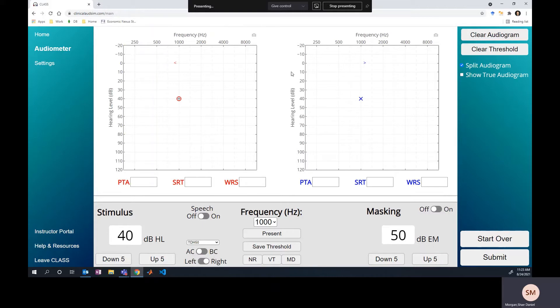I've set up a special case here in the CLASS program to demonstrate this effect. You've done the air conduction and bone conduction thresholds unmasked for both ears. We're just doing one frequency here for illustration — 1000 Hz. The next step is to decide if you need to mask your air conduction thresholds.